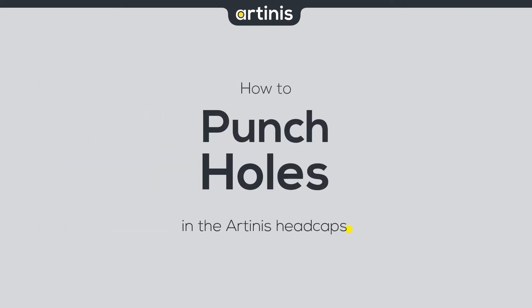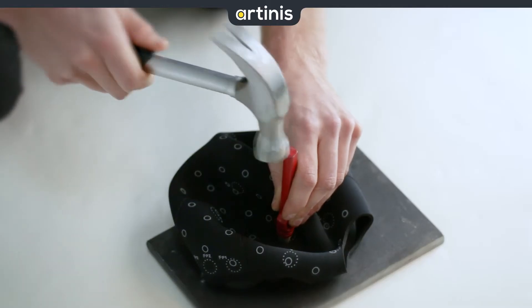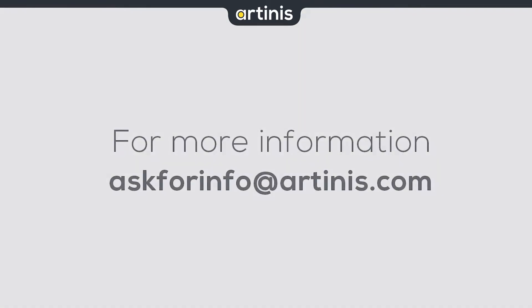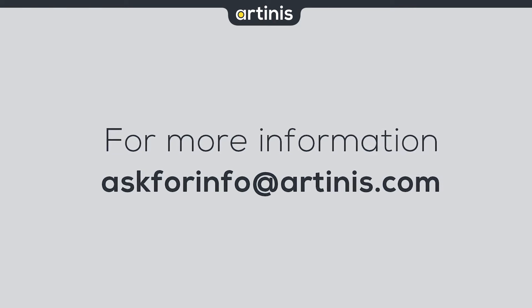Hello, my name is Jerry and in this video we will show you how to punch holes in the Artinis headcaps. We will discuss the basic template configurations, perfect punching technique, and the associated safety regulations. For more advanced information, please contact us via askforinfo at artinis.com.